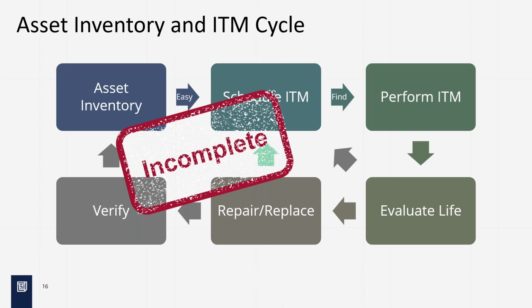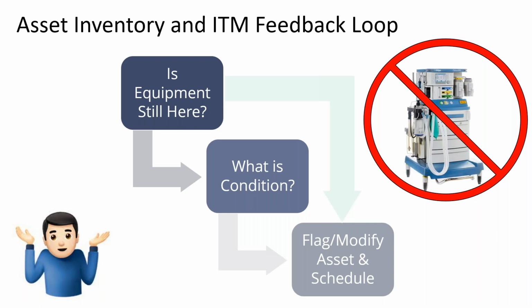And most of your equipment is mobile, at least volume wise, maybe not financially wise. So part of it is when you're structuring your procedures, when you're performing your ITMs or PMs, how do you automate some of those things? How do you put policies in place to do that?